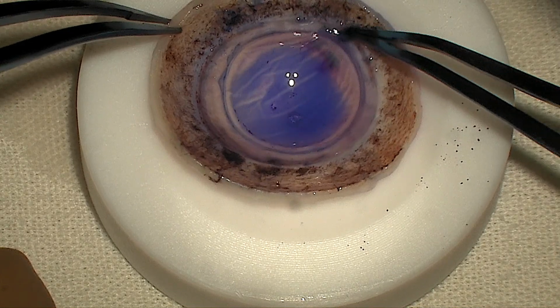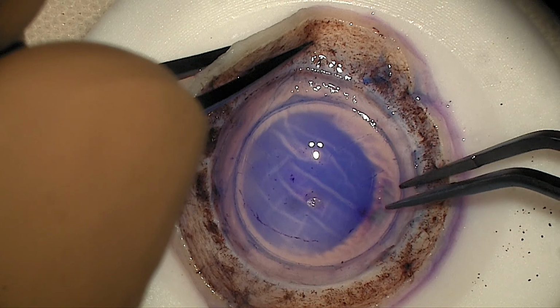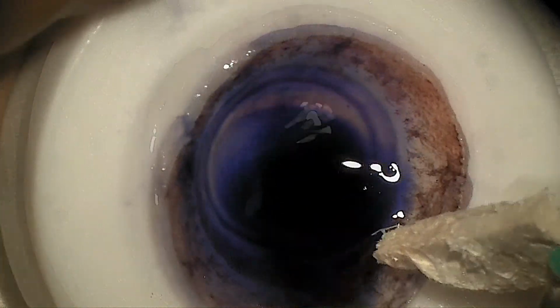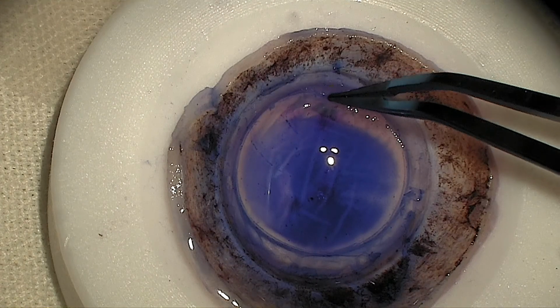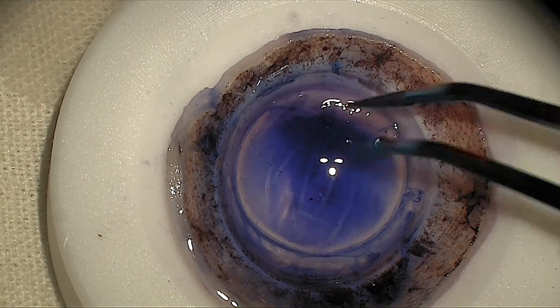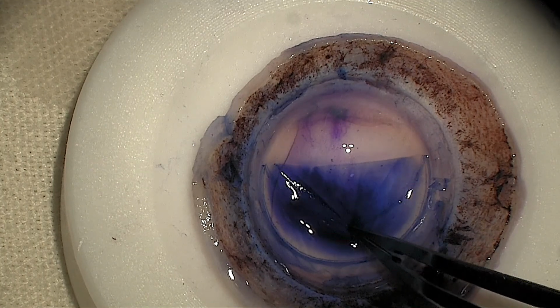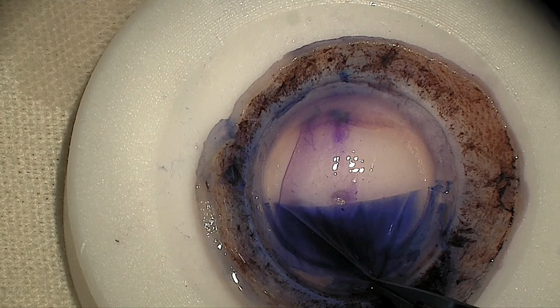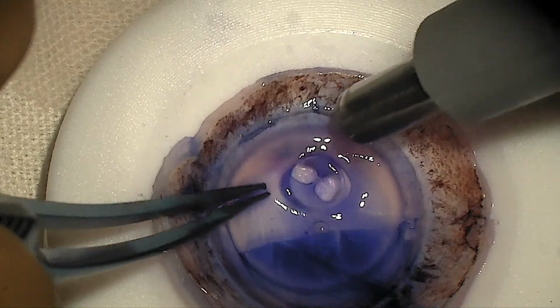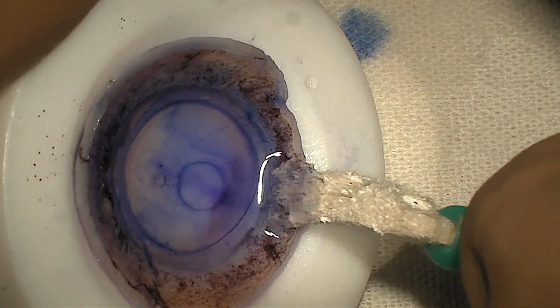The peripheral DM endothelium beyond the trephine mark is stripped off, and the Descemet edge is identified and gently loosened all around. The DMEK graft is then peeled starting from the superior cornea with the help of McPherson's forceps, and keeping a 3 to 4 mm hinge near the inferior part. A paracentral 3 mm stromal trephination is done, and the peeled off DM is floated back to the original position.